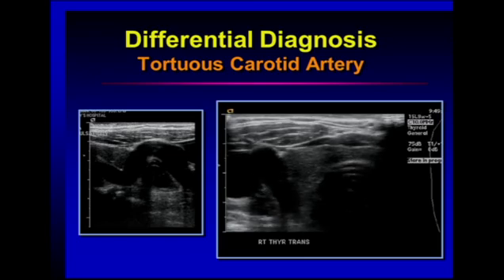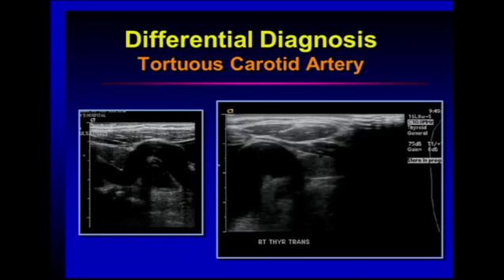Note the tortuosity of the carotid as it angles towards the skin surface and makes a loop, so it can feel like a mass to the clinician.